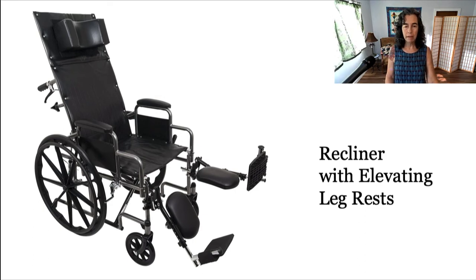And notice that the back is extended. So if the person doesn't have good head control, we can accommodate for that. On the back as well, you can see one of the push bars back there, and notice that it has a brake on it. So that's another feature.